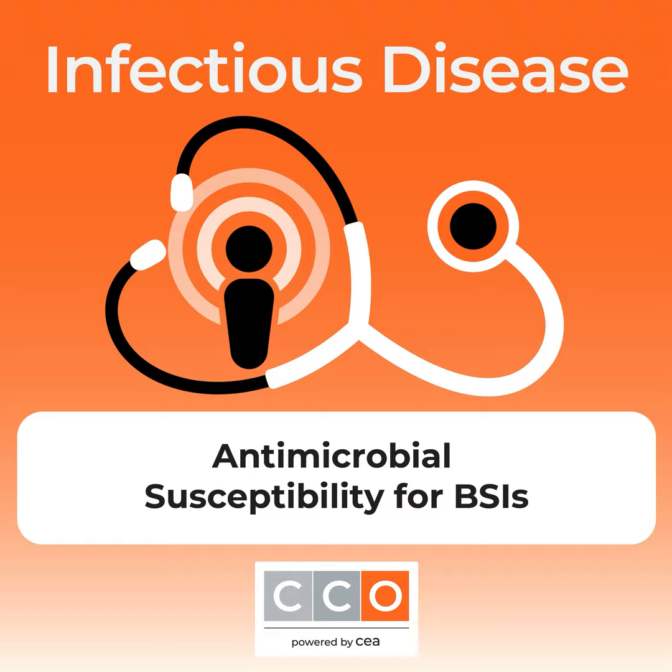The famous Luminex Verigene, the battle horse, that I don't know if it's still around. Some people use MALDI-TOF with a specific protocol to identify directly from blood. Some FISH technology, and the T2 Biosystems, which actually works from direct blood, not from a positive blood culture. But ultimately, the important thing is there are still facilities across the US that don't use BCID. And it's kind of mind-blowing that we have this amazing technology to optimize treatment based on organism identification, with good cumulative data on antimicrobial resistance genes, and it's still not in use.